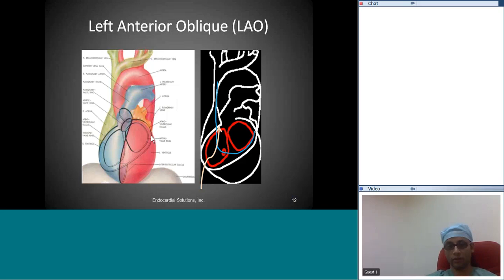Okay. And your right ventricular catheter, I showed you on the other occasion, comes directly facing you down like here, and the high right atrial catheter will go up here. So that's the reason you need to be good with your fluoroscopic projections. One of the best things to do is take a few coronary angiograms, because your circumflex, anterior descending, and the right coronary would give you some sort of information about what it would mean.